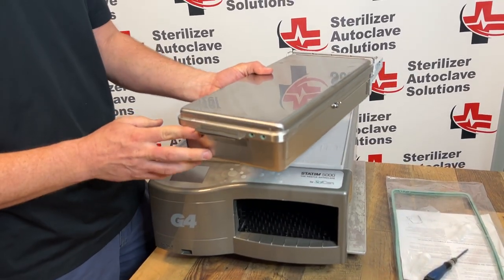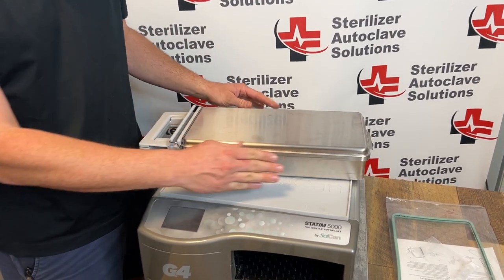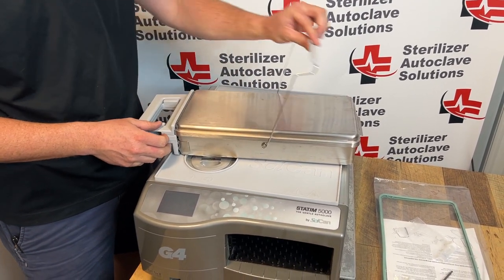First thing we're going to do is remove the cassette. I'm placing this on top of the unit. I do have a stat mat on top so I do not scratch the surface.